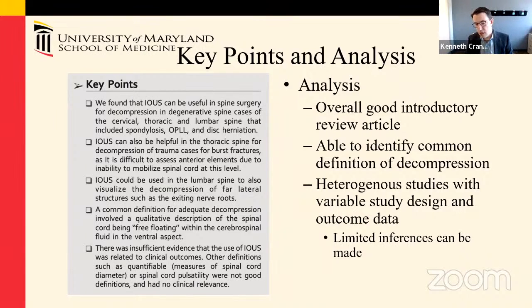The other idea that I had, which has to do with probe size, is I tried using one of our probes on a lumbar microdisc just to see if there was a residual disc fragment after you removed the main disc fragment. Unfortunately, I wasn't able to get the probe into my small microdisc incision with enough depth to see what was going on.